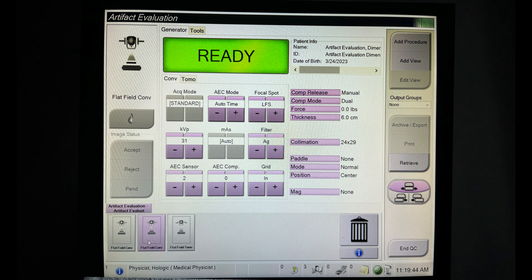We'll want to note any technical factors or artifacts present on our QC records. We'll then select the next flat field conventional tab and ensure that these techniques are set. We'll then acquire and review that image in the same way as the previous one.